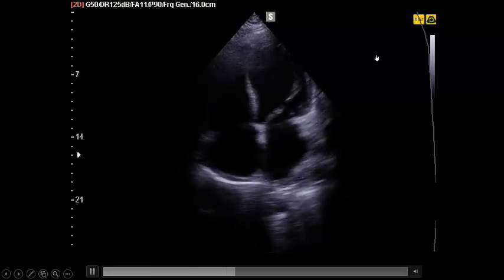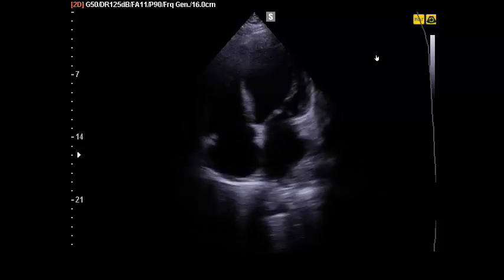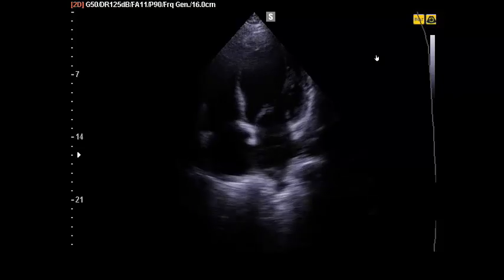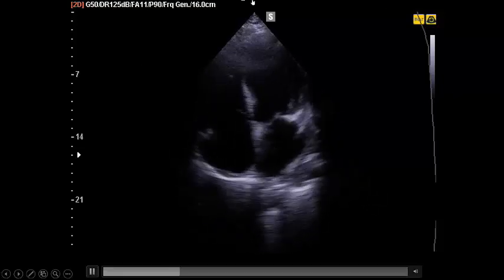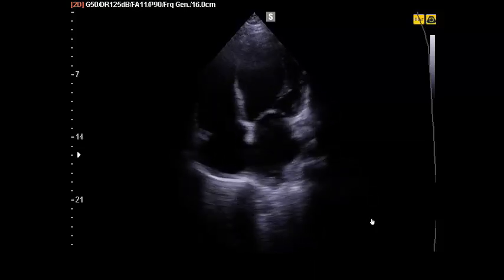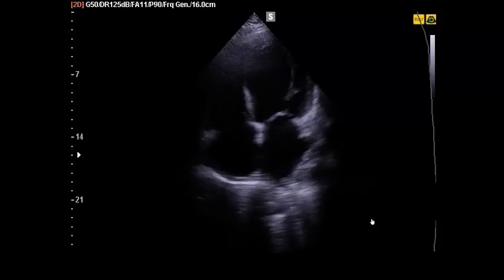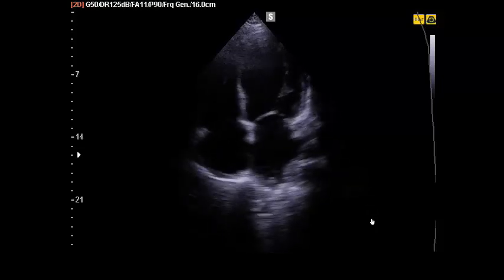In this type of patient with a dilated non-collapsing inferior vena cava, from the advanced critical care point of view, with this type of left ventricle and this acute event in a patient with dyspnea and shock, you need to assess 2 important things with this bad left ventricle.